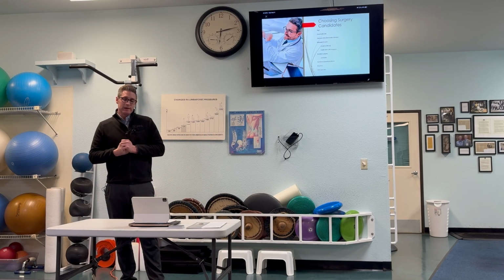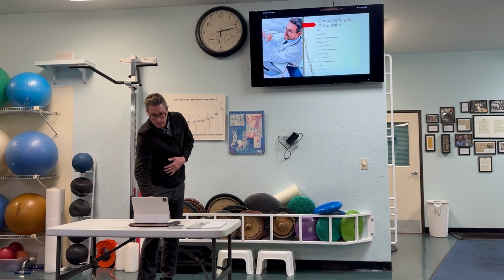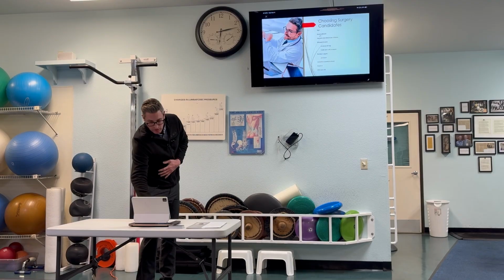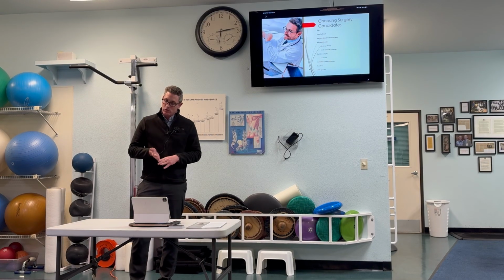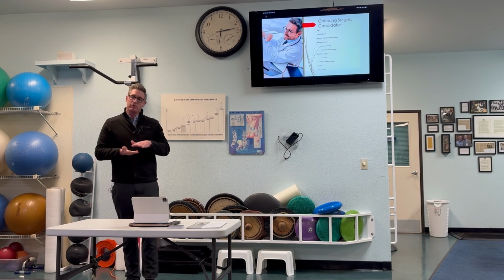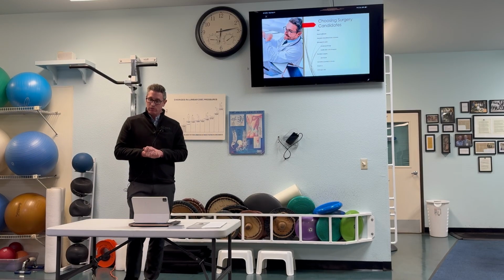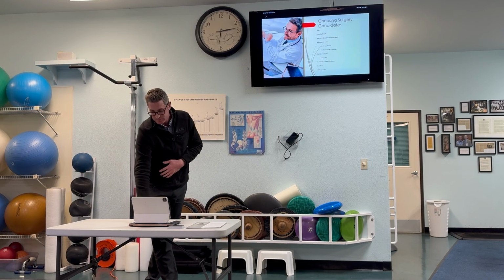we may need. And really for the lumbar disc arthroplasty, these top several categories are what we're looking for, somewhat of an inclusion criteria, whereas these bottom ones are ones where we would rule out that particular treatment as an option. So if they've already had a fusion, if it's a revision surgery, severe osteoporosis, instability, fracture, those would not have a good indication for disc arthroplasty.